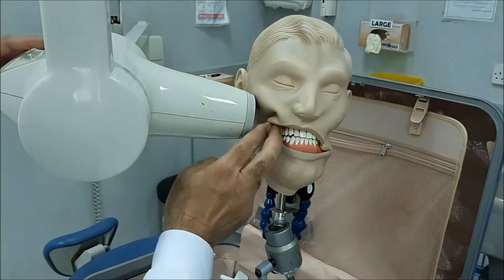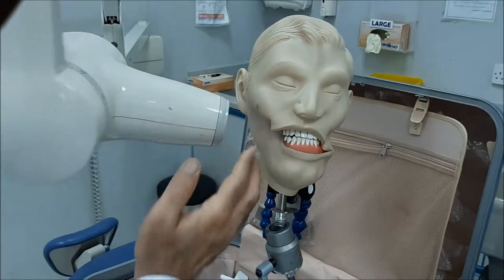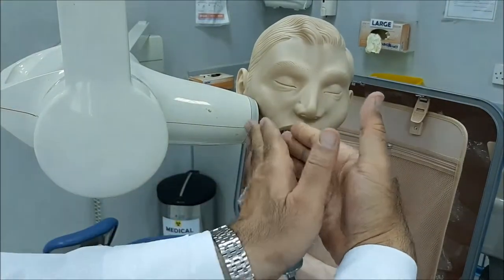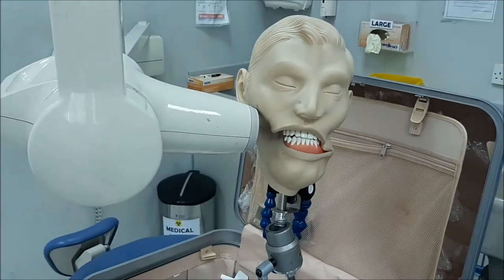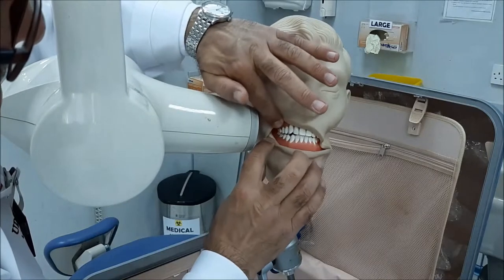For the horizontal angulation, you will try to make the margin parallel with the buccal surface of the teeth. If you make those two parallel, you will guarantee that the x-ray is passing between the teeth with no overlapping of structures.